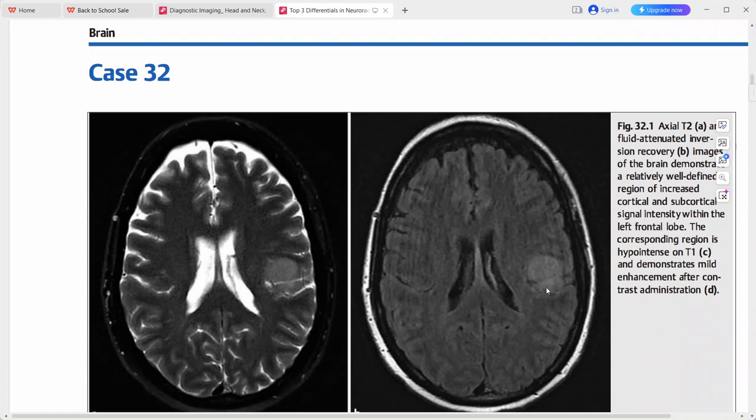Considering this key imaging finding of a solitary region of cortical and subcortical signal abnormality in an adult, the top differential is low-grade astrocytoma. Other differentials include ischemia or infarct, cerebritis, contusion, or seizure edema.